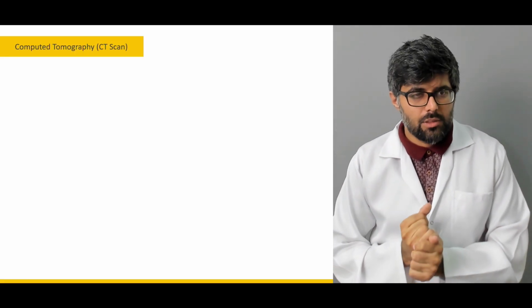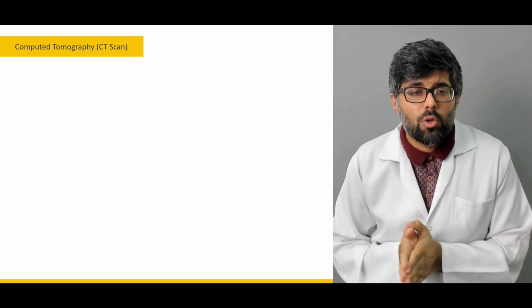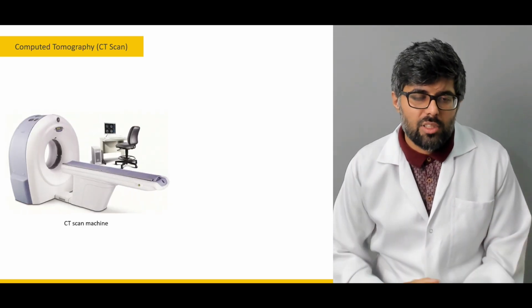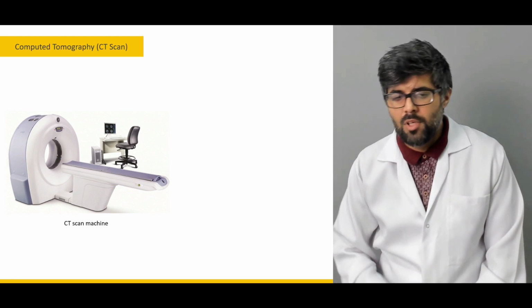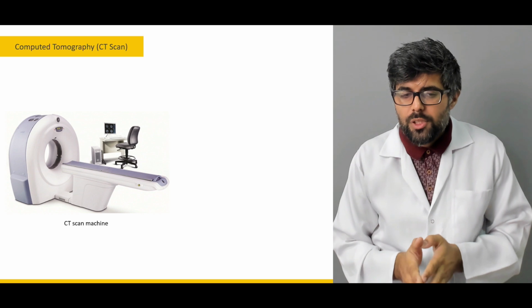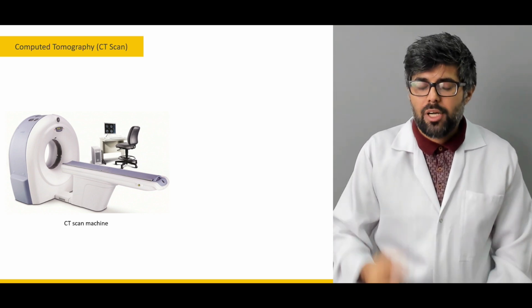Okay, next. Next modality is the CT scan or the computed tomography. Now, here is an example of a typical CT scan machine. Now, if you compare it to the earlier one, the conventional one, you will notice that it's kind of the same, but it's more advanced.